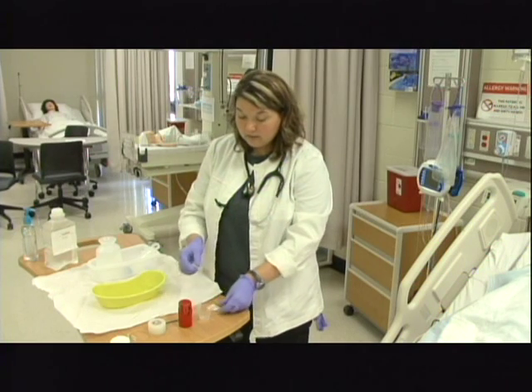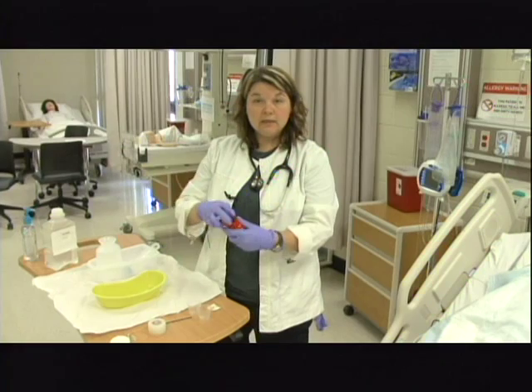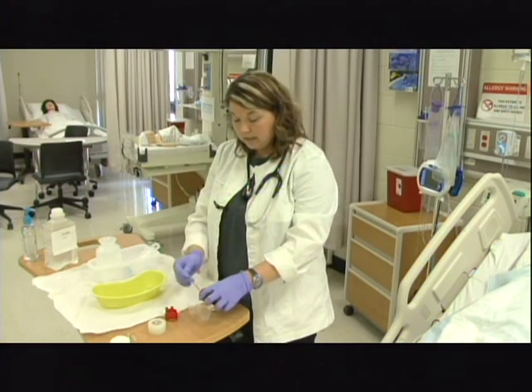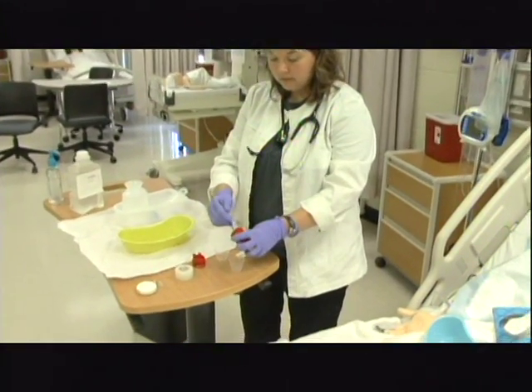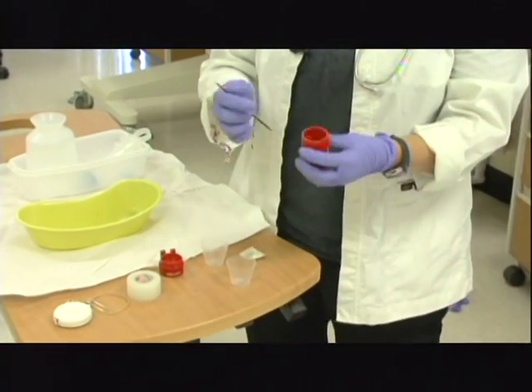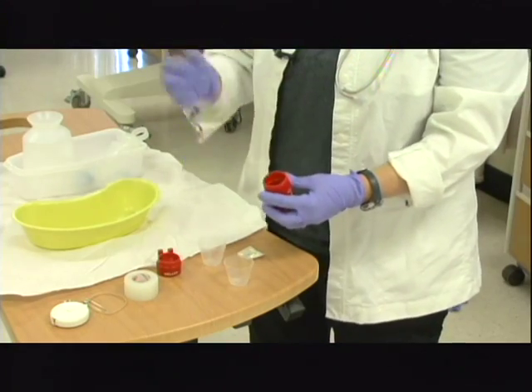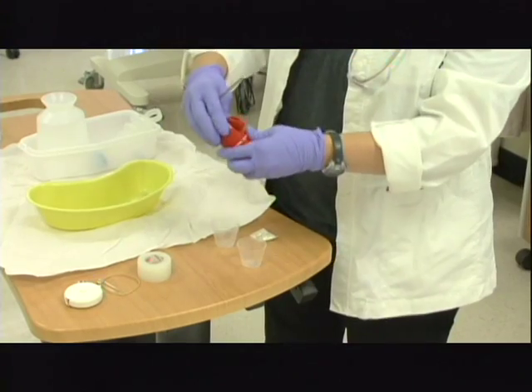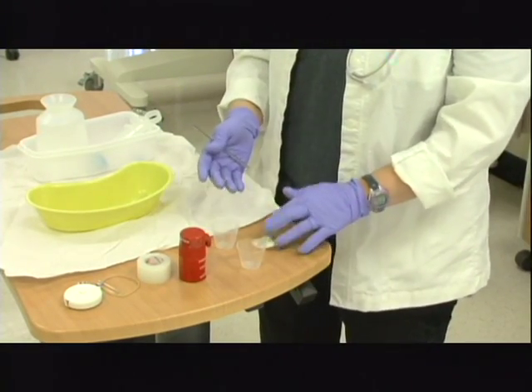So we would have gotten the individual pill, and we would come over here with the crusher, and you would put the pill in here and crush the medication, and then you would take it and put it into the individual container in which to give the medication. And I would put that in here. And then if I had a second one, I would need to clean in between the medications, crush the second medication, and use a different straw and put the medication down in the second cup. So we're going to say that I have 2 different medications in 2 different cups that have been crushed.